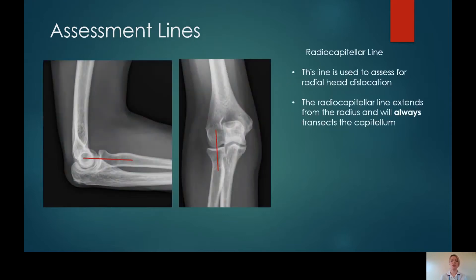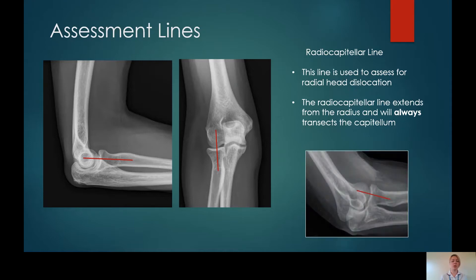The other assessment line that you need to be familiar with is the radial capitella line. This extends through the radial head and neck and bisects the capitellum. The radial capitella line always runs through both the radial head and the capitellum, no matter what projection has been acquired, as seen here in this oblique elbow as well. If the radial capitella line does not bisect both the capitellum and the radial head, you'll be looking at a radial head dislocation.